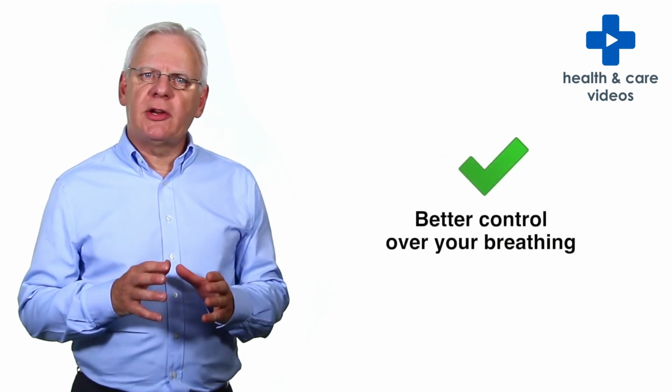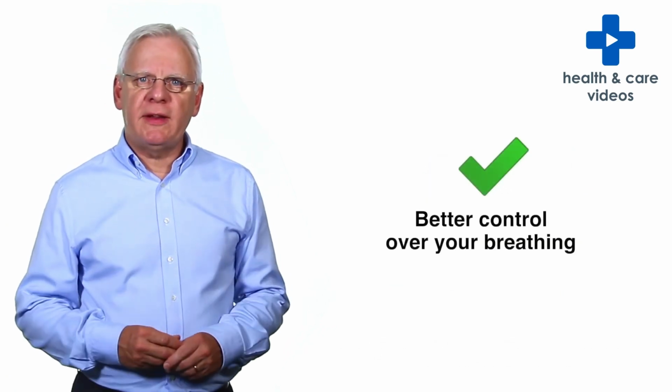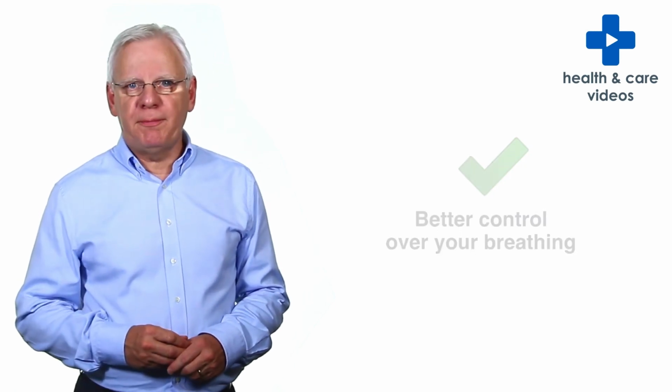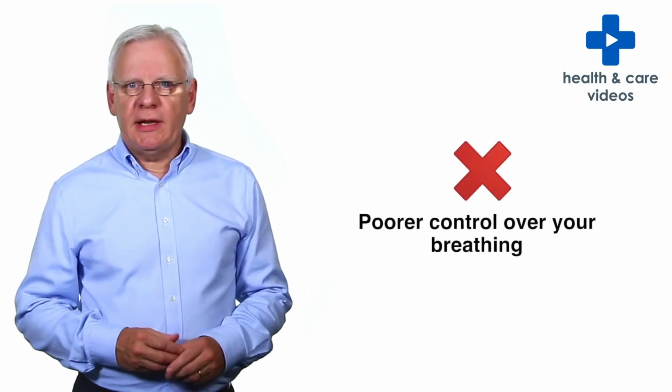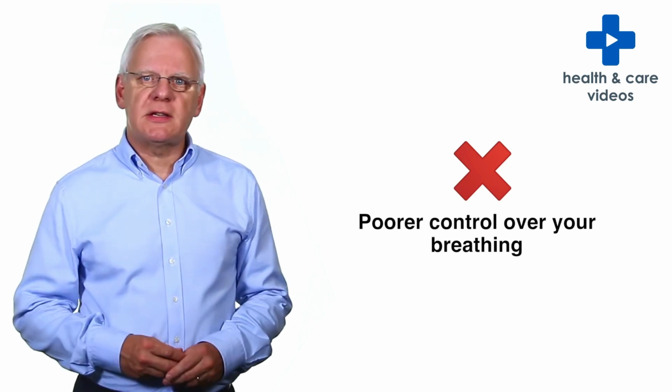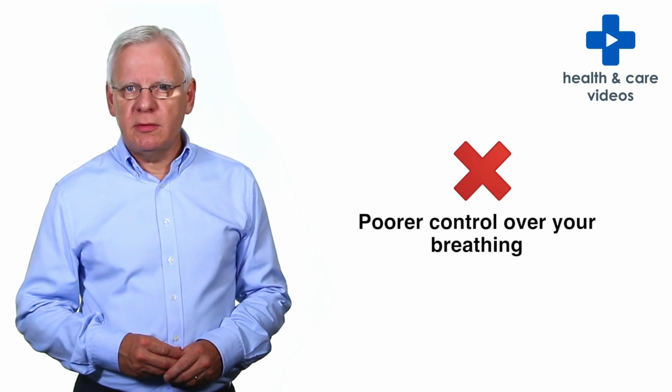If you use your inhaler correctly, you will get more of the medication into your lungs, giving you better control of your breathing problem. But if used incorrectly, you may have poor control of your condition, with the risk of side effects, such as a sore throat or mouth infection.